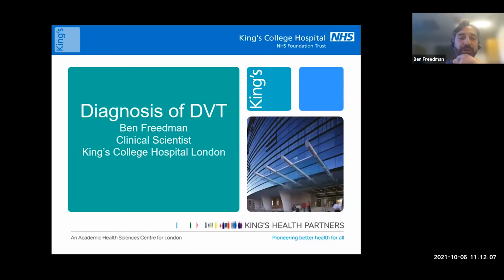As was mentioned, my expertise is in ultrasound imaging of vascular conditions. Of course, DVT is one of the largest parts of our work. So I'm going to talk to you about primarily ultrasound diagnosis for DVT.